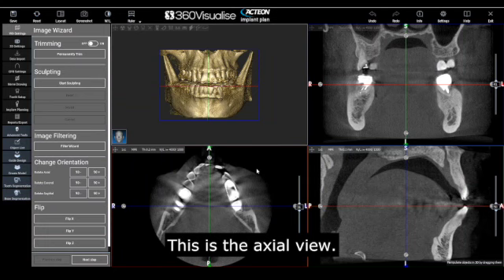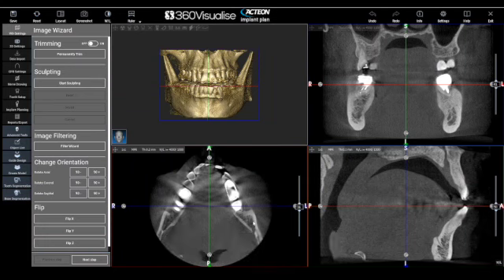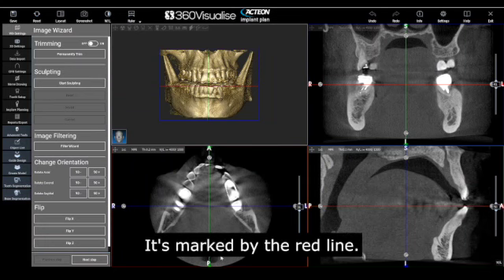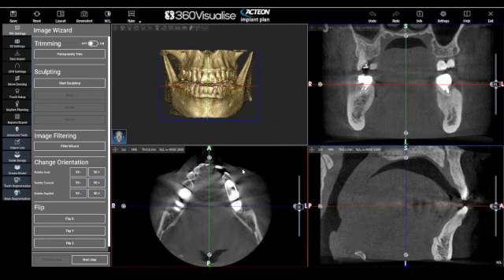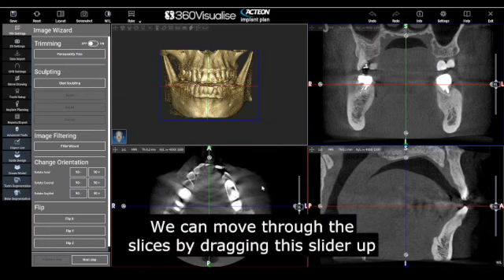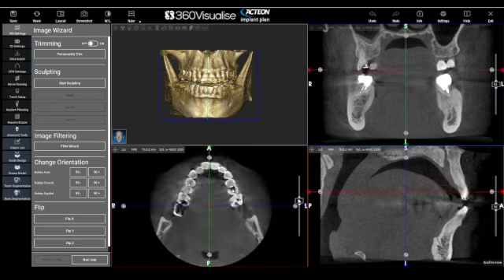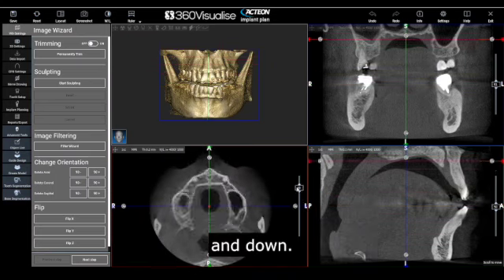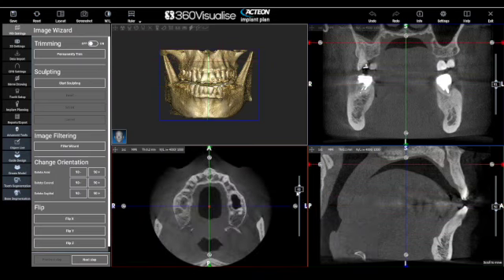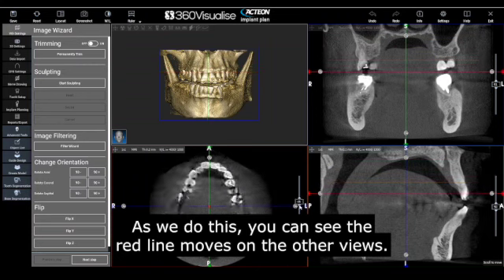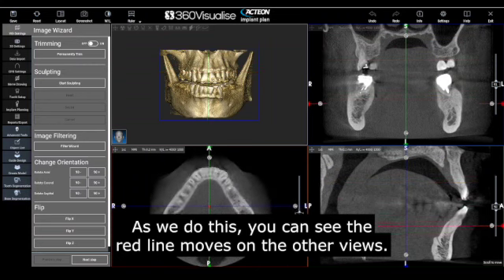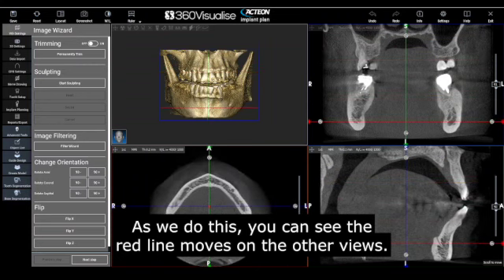This is the axial view, marked by the red line. We can move through the slices by dragging this slider up and down. As we do this, you can see the red line moves on the other views.